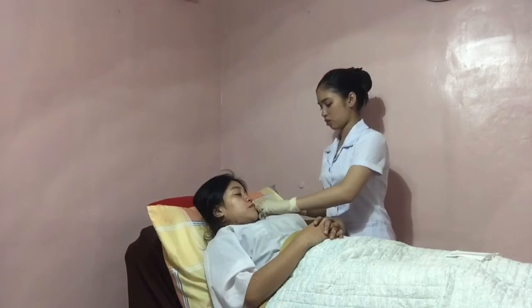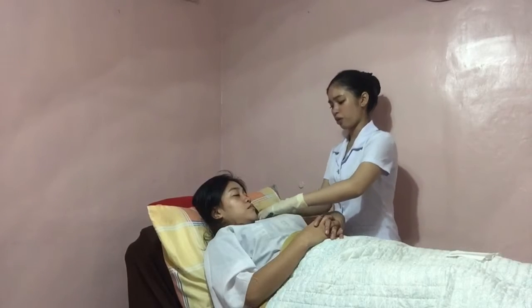For the axillary temperature method, ensure the client's privacy and of course help the patient to the supine or sitting position. Althea, I'm gonna move the gown away from your shoulder and arm. Is that okay? So can you raise your arm away from your torso for me? So of course, inspect the axillary area for any lesions or perspiration. And pat the axillary area dry if needed.